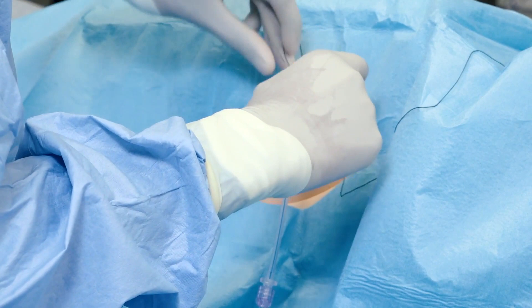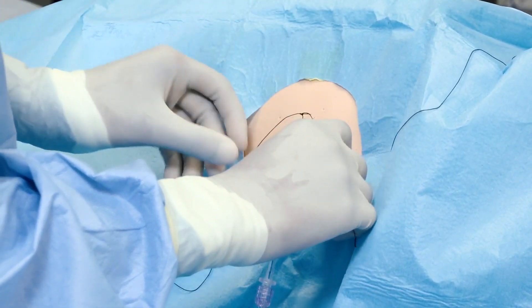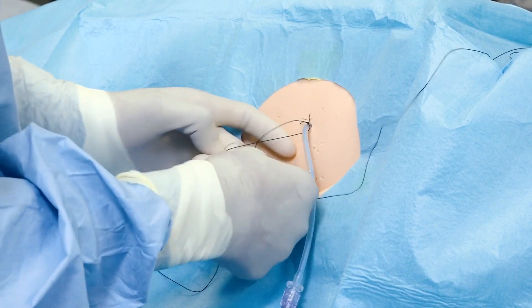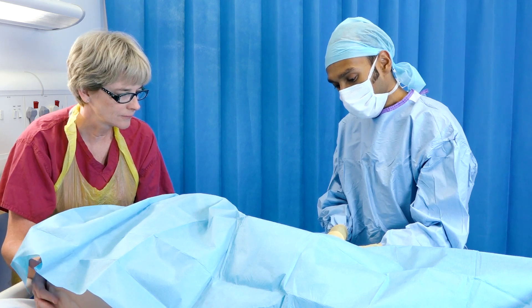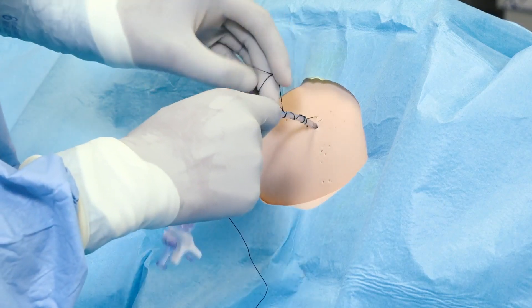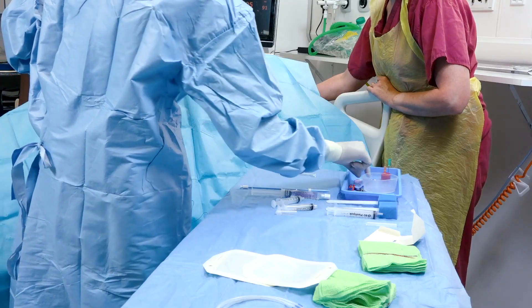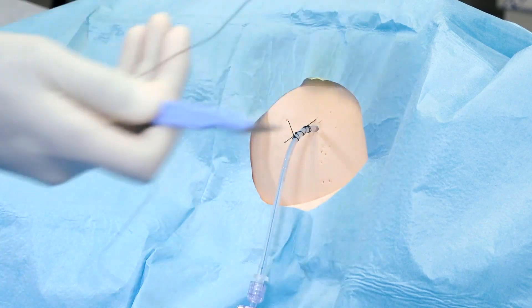A small bore drain inserted under Seldinger technique, as shown here, would require one suture to secure the drain in situ. Large bore drains often require two sutures: one intended to secure the drain, the other used to facilitate wound closure upon removal.